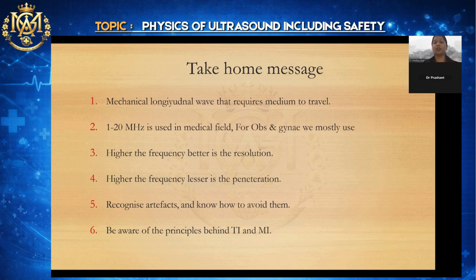Next, you have to understand the knobology and transducer selection. Knobology and transducer selection is a very long topic. Each and everything I told you, you have to understand how to change the depth, how to change the gain, how to adjust the TGC. And for that, I have videos for everything.